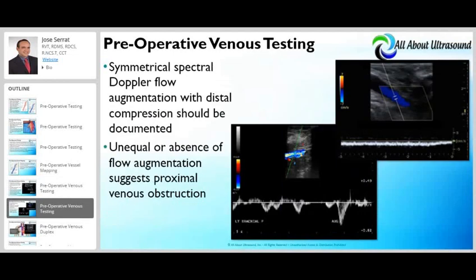Symmetrical flow augmentation with distal tissue compression should be documented, and absence of flow augmentation may suggest proximal venous obstruction. It is important that the sonographer notes the patient's position while examining upper extremity central veins, since examining patients in a sitting position will reduce venous pulsatility and phasicity.